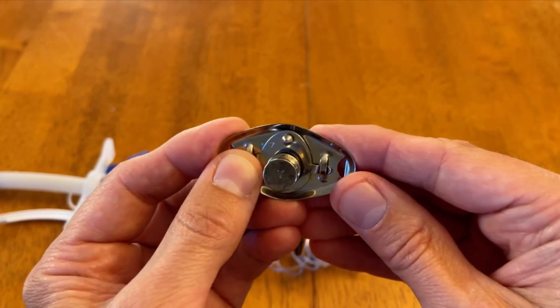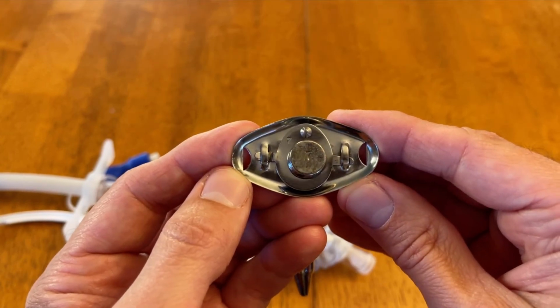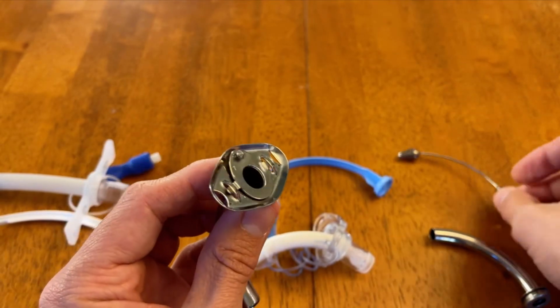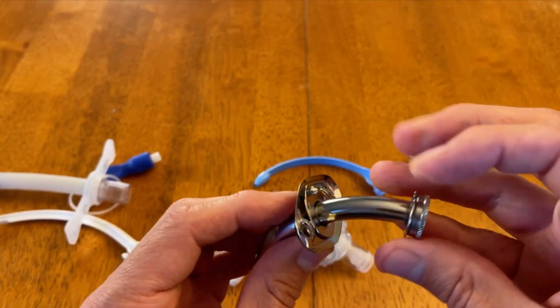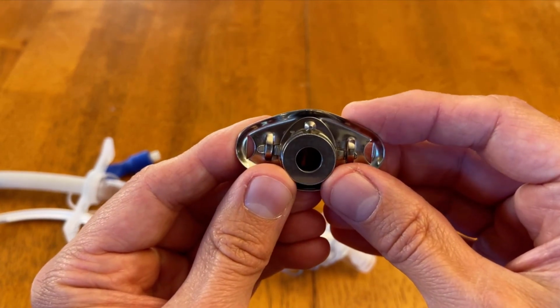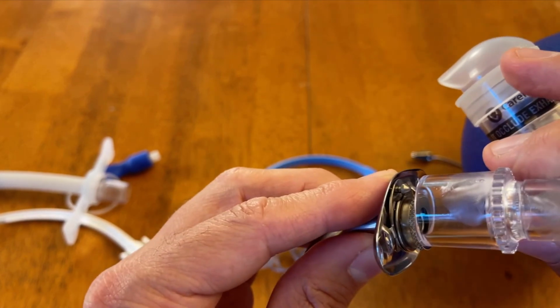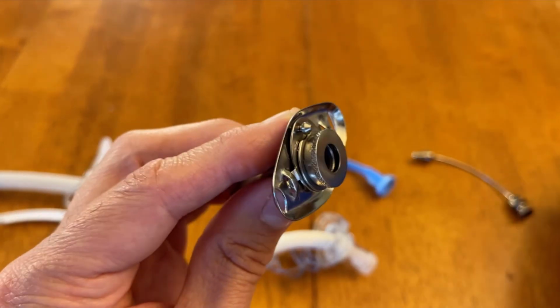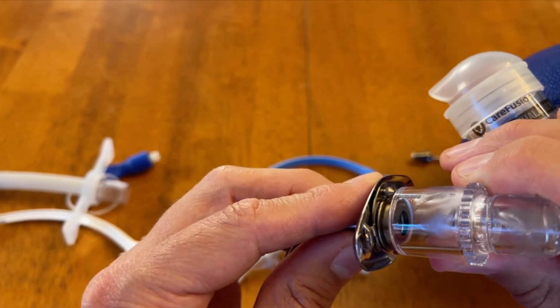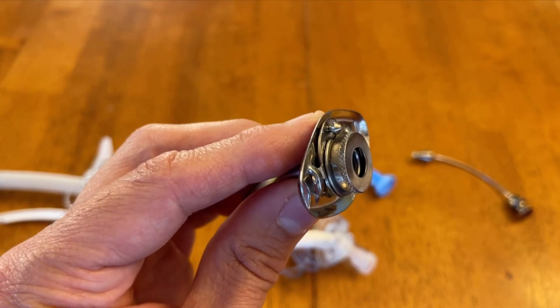But as we talked about or alluded to earlier, when you're in the emergency department and you're evaluating a patient with a tracheostomy, you really want to make sure that you have a tracheostomy that has the hub with a 15 millimeter adapter. If you need to supply positive pressure ventilation, then you need to be able to hook this up to the patient somehow. But as you can see with this particular trach, I cannot hook this up to my bag valve mask or my ET tube circuit, so I would need to change this cannula out.